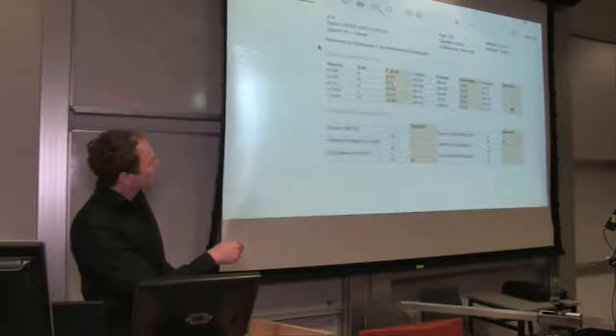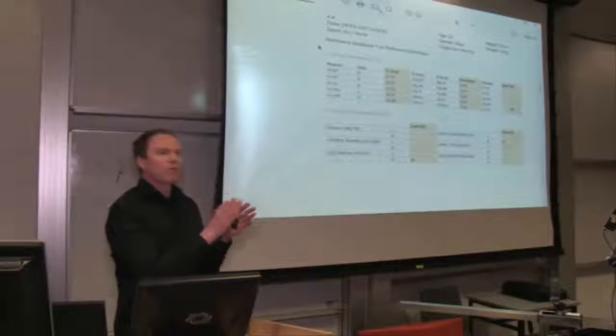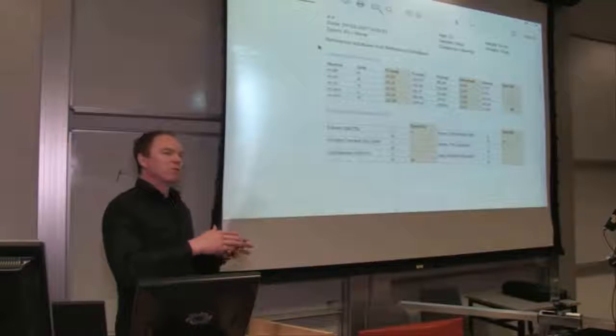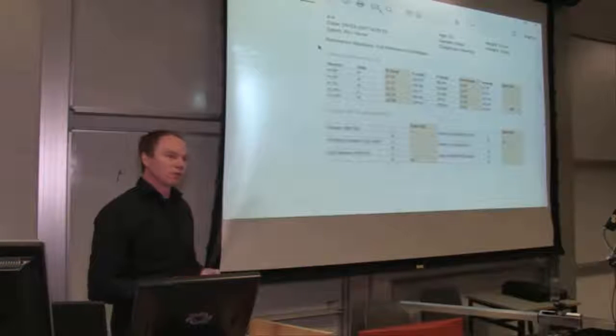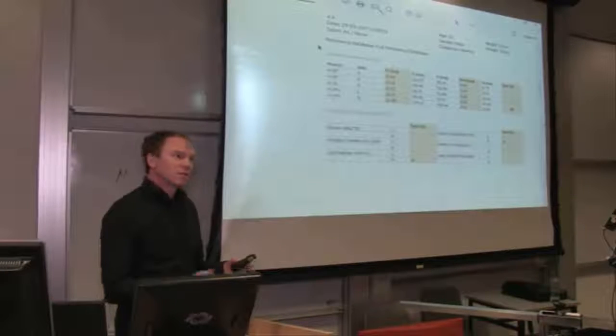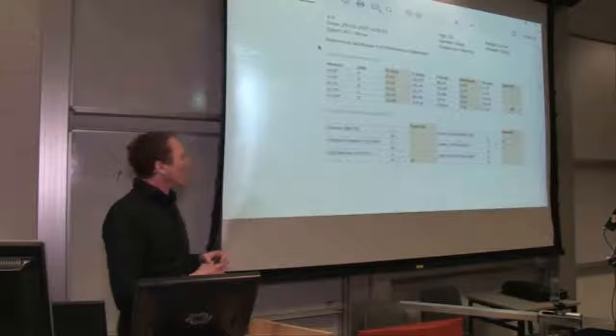So as you can see here, the range of these muscles for him is from 22 up to 25 milliseconds, which is very good. Usually you would see a variation which is much, much bigger. But okay, he's a runner. That's something that he needs to have if he wants to be a good runner.